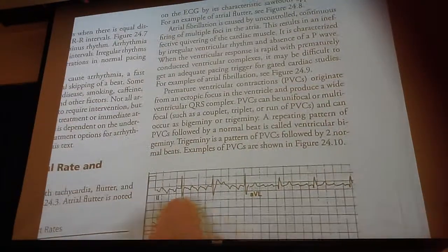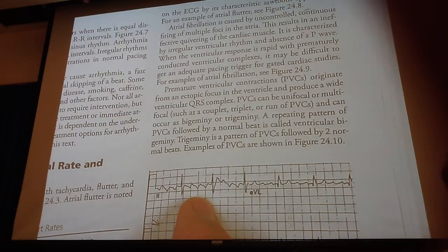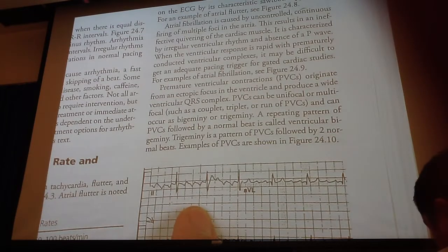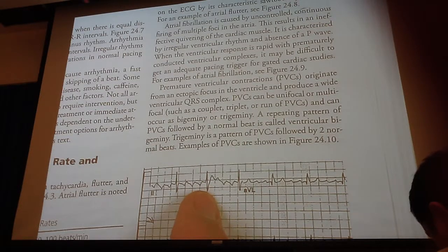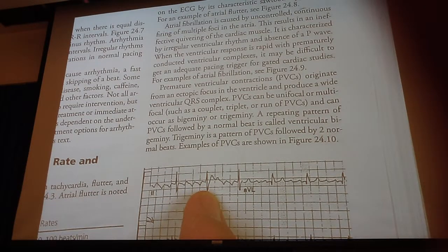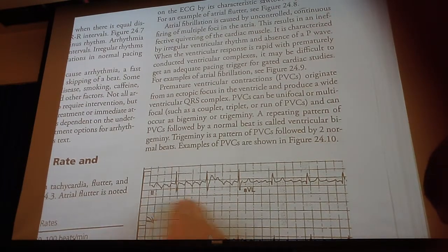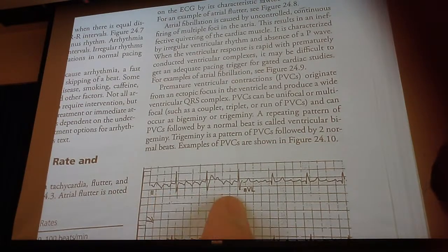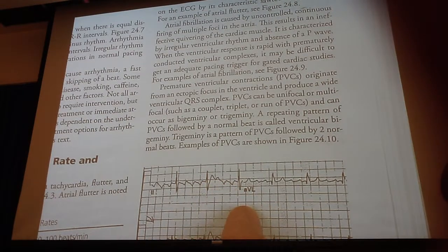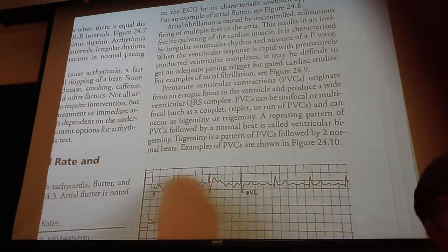Okay, you guys had EKG training, so what's going on here? What is that? Atrial flutter. What's fluttering? Is that fibrillation? Your heart is fluttering, yeah, but what part of the heart? Atrium. Okay, yeah, because your ventricles are still working fairly normally. Here's your QRS pattern here, so that's okay. Yeah, that's atrial flutter. We also call that a sawtooth.